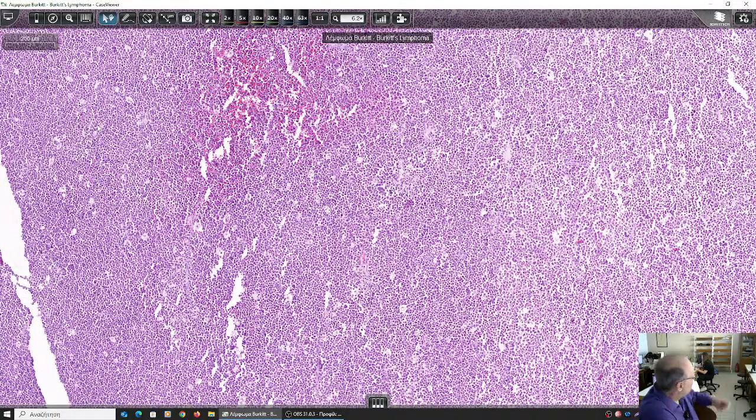Why? Who can tell me? Thinking from a clinical point of view. Because you started chemotherapy too early, and you didn't have a very favorable result, because you expected it not to respond, because it was low grade. However, the lymphomatous cells learned the drug. And what did they develop when they were transformed into high grade?